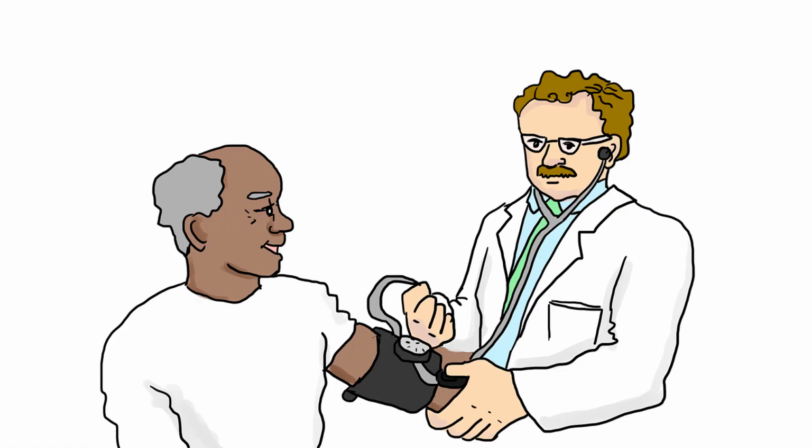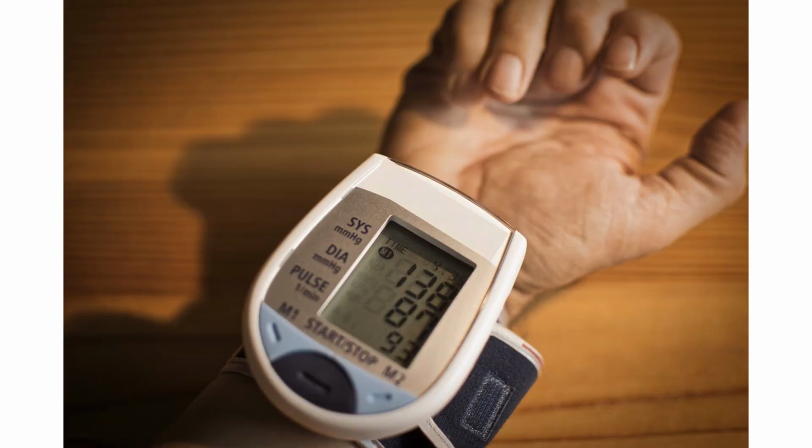The technical name of the device used to measure blood pressure is sphygmomanometer, but this name is seldom used and often it is called a BP apparatus. The older generation mercury BP apparatus is now obsolete, being replaced by aneroid equipment almost universally. Blood pressure is measured by inflating a cuff on the limb on which it is to be measured. BP measured in the thighs is usually higher than in the arm. BP can also be measured at the wrist.